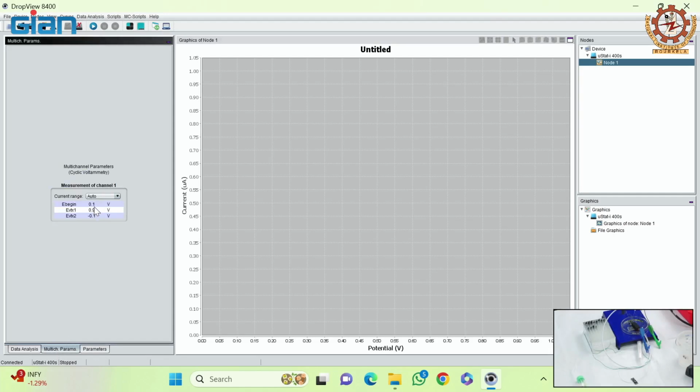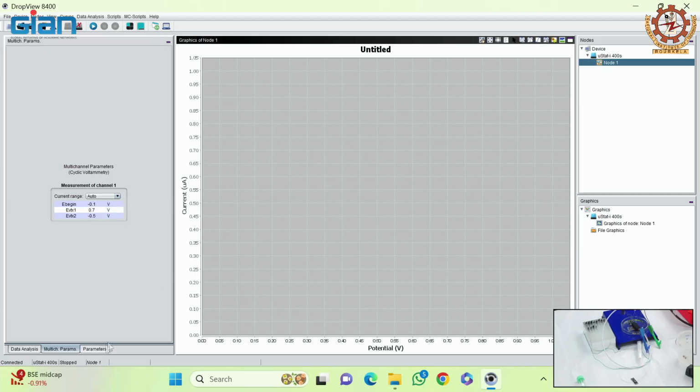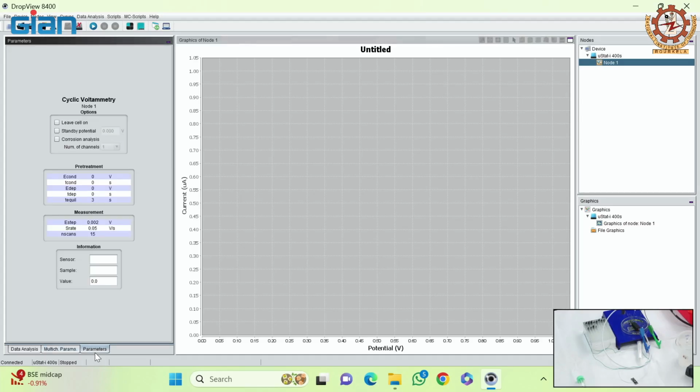As you know, this is a single channel potentiostat. We can do one working electrode at a time. If it had been multi channel, there is a chance of functionalizing, or electropolymerizing, all the working electrodes at the same time as well. For demonstration purposes, we will be doing it for one working electrode only.